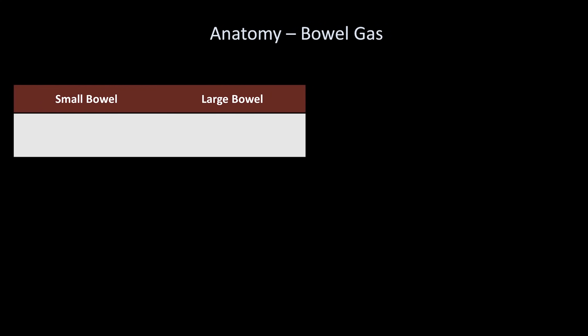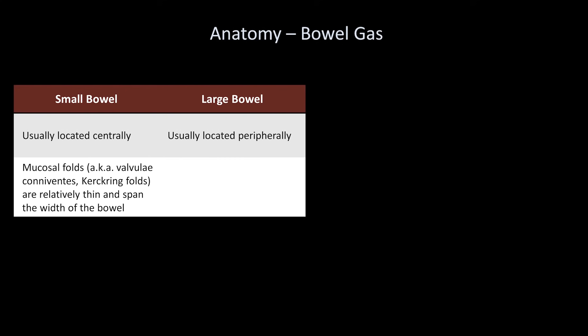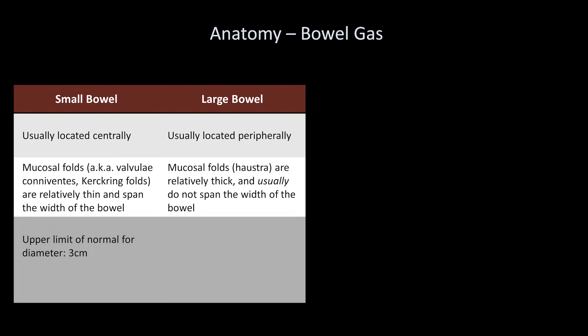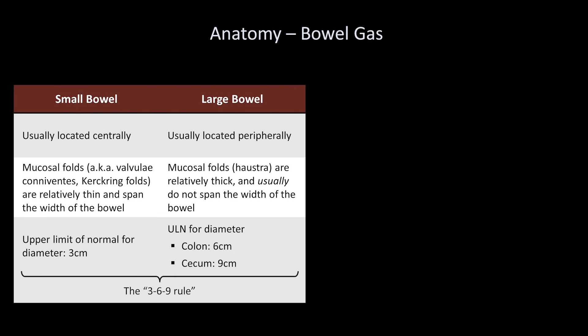Differentiating small and large bowel is not always possible, but there are a few clues. The small bowel tends to be centrally located, while the large bowel is on the periphery. The small bowel's mucosal folds, known as valvulae conniventes or Kerckring folds, are relatively thin and span the width of the bowel, while the mucosal folds in the large bowel are called haustra, which are relatively thick and usually do not span the width of the bowel. The upper limit of normal for the diameter of small bowel is 3 centimeters; for the large bowel it's 6 centimeters for most of the colon, but 9 centimeters for the cecum — known as the 3-6-9 rule.